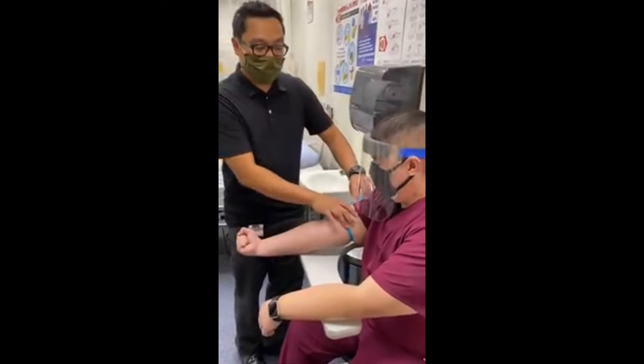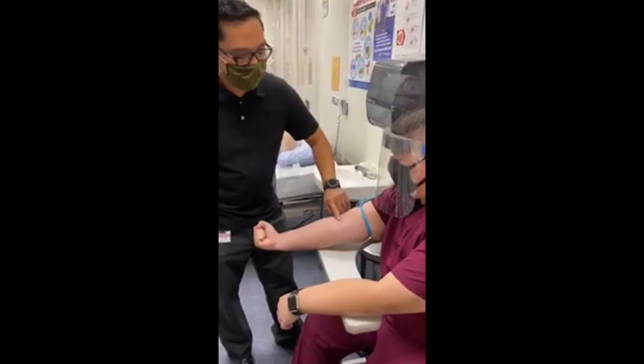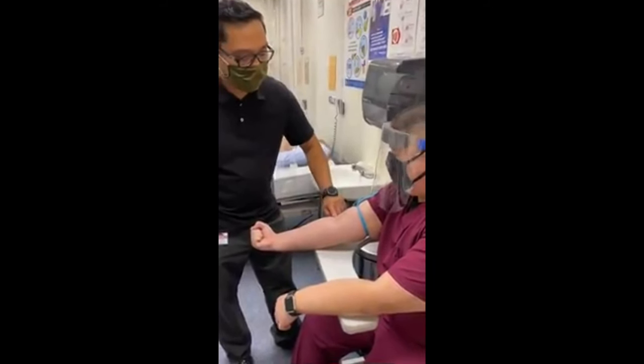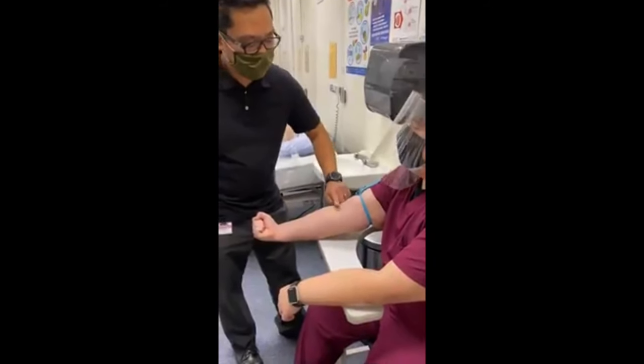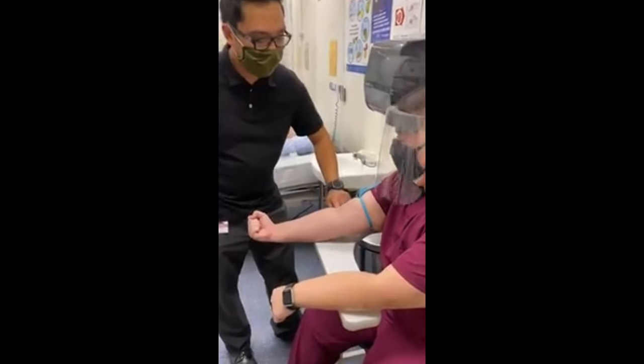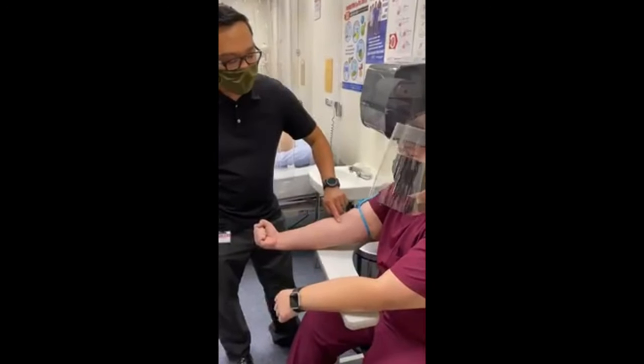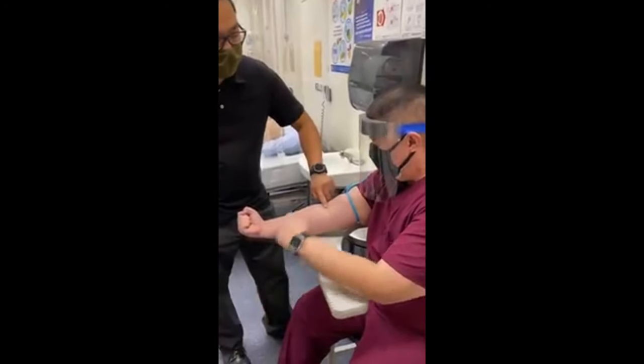Is it tight for you or is it fine? That's good. I'm going to feel for your vein. Is it hard? No, it's there. Yeah, he has one here. And what vein would that be? This is the antecubital, the median antecubital here. And the vein that runs, it's popping up now slowly. You can feel it.